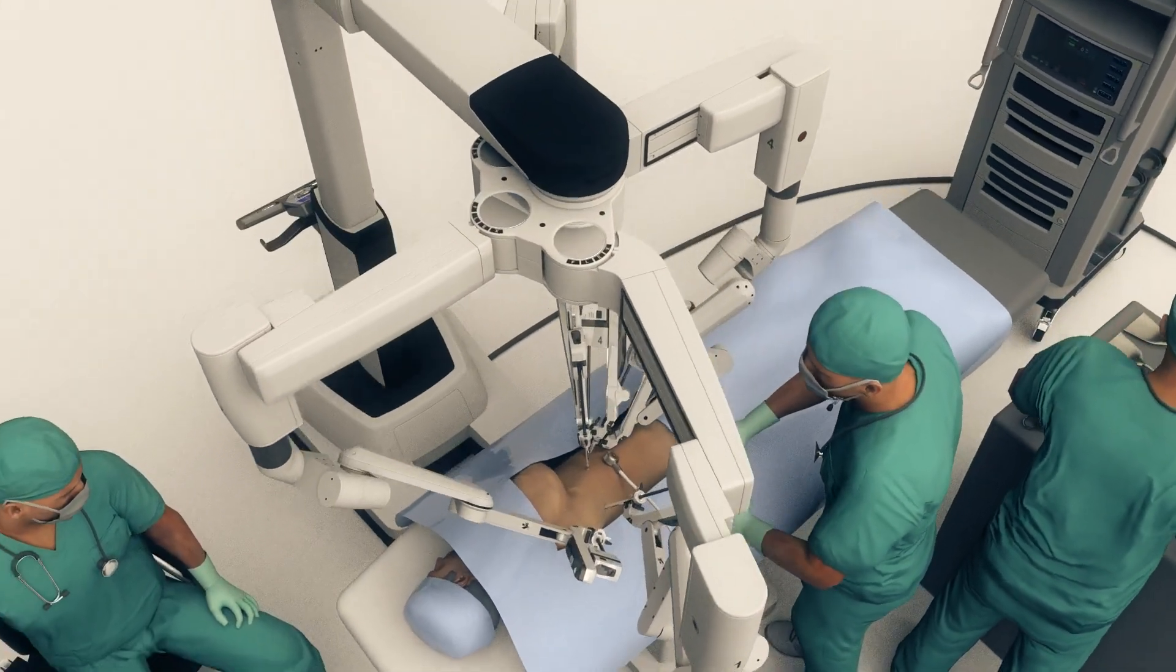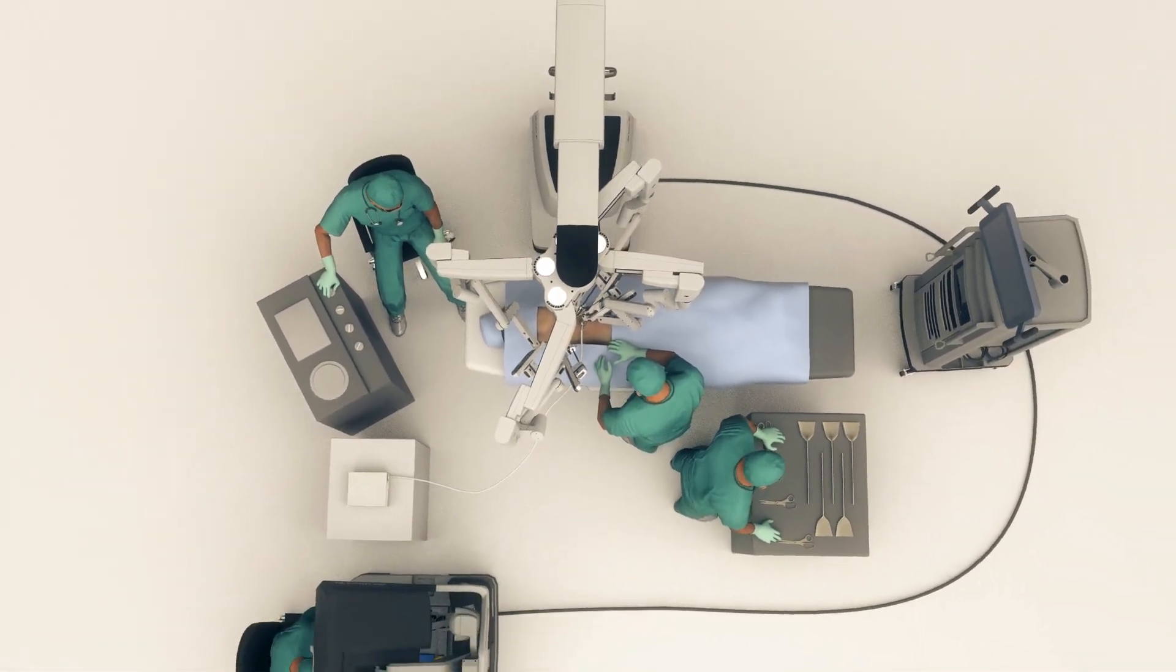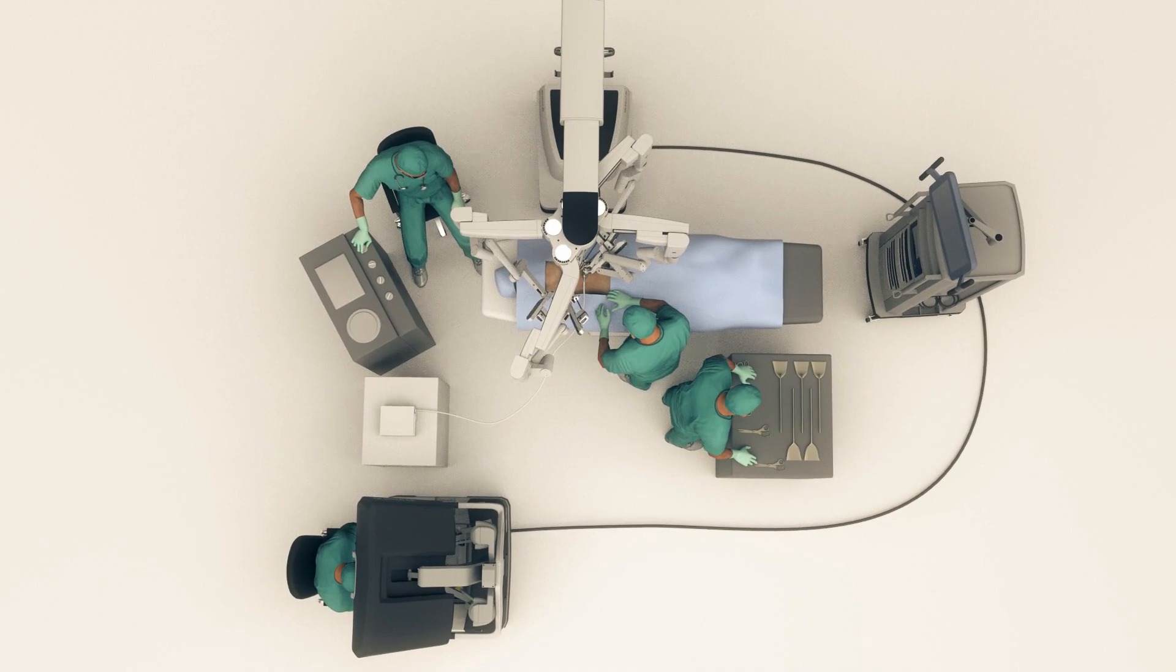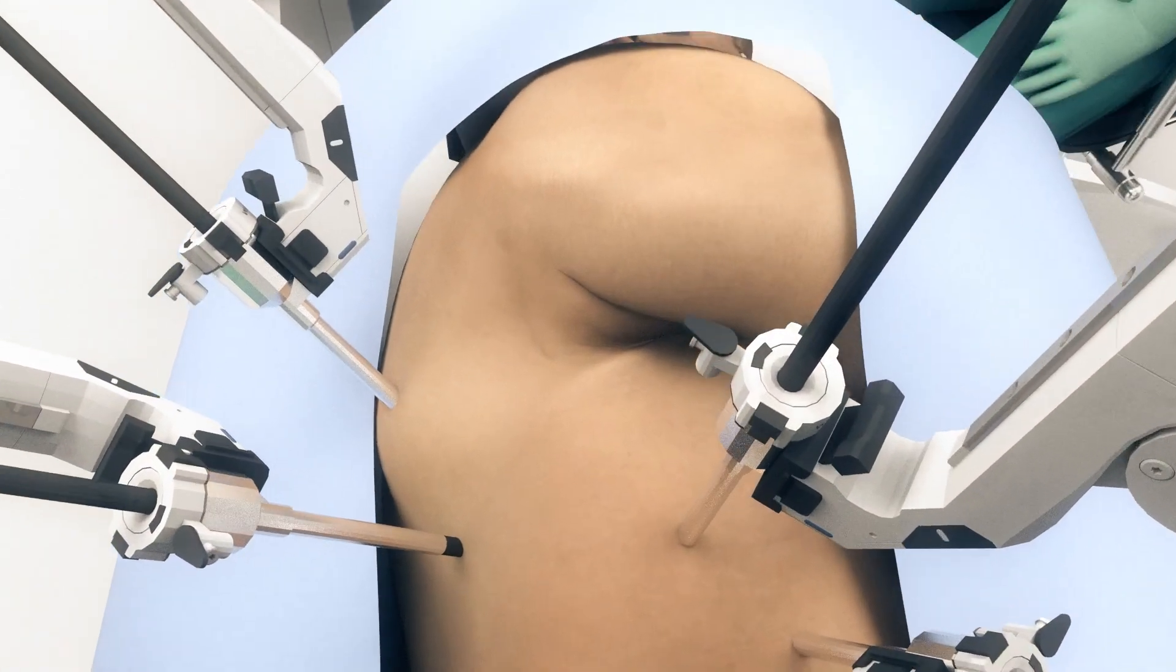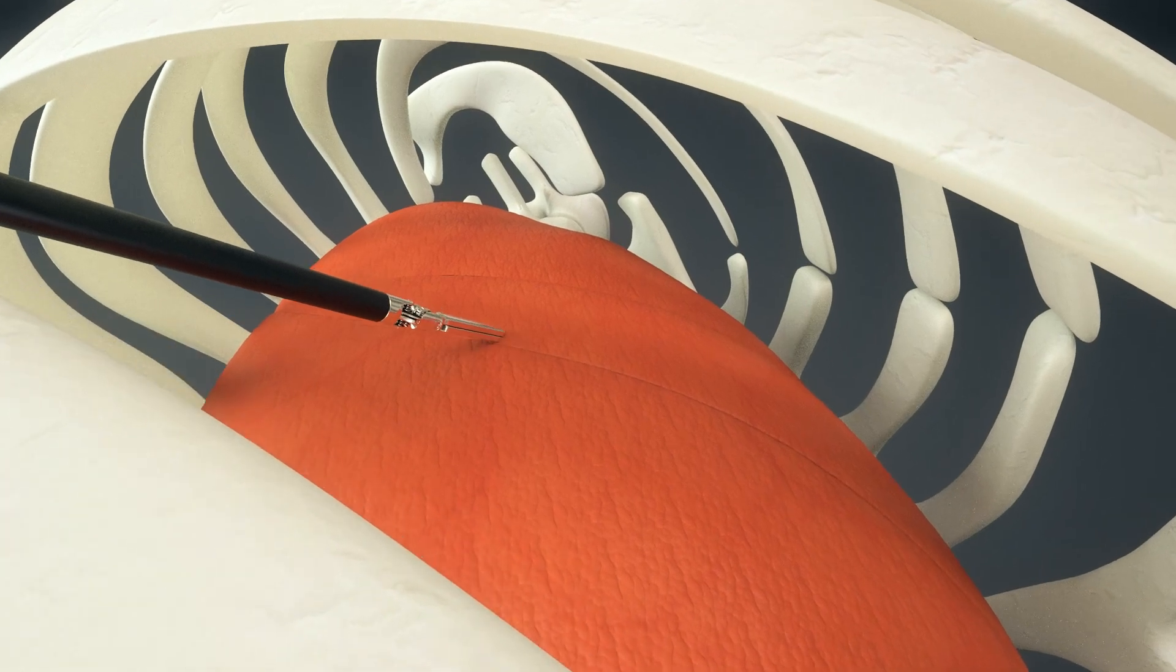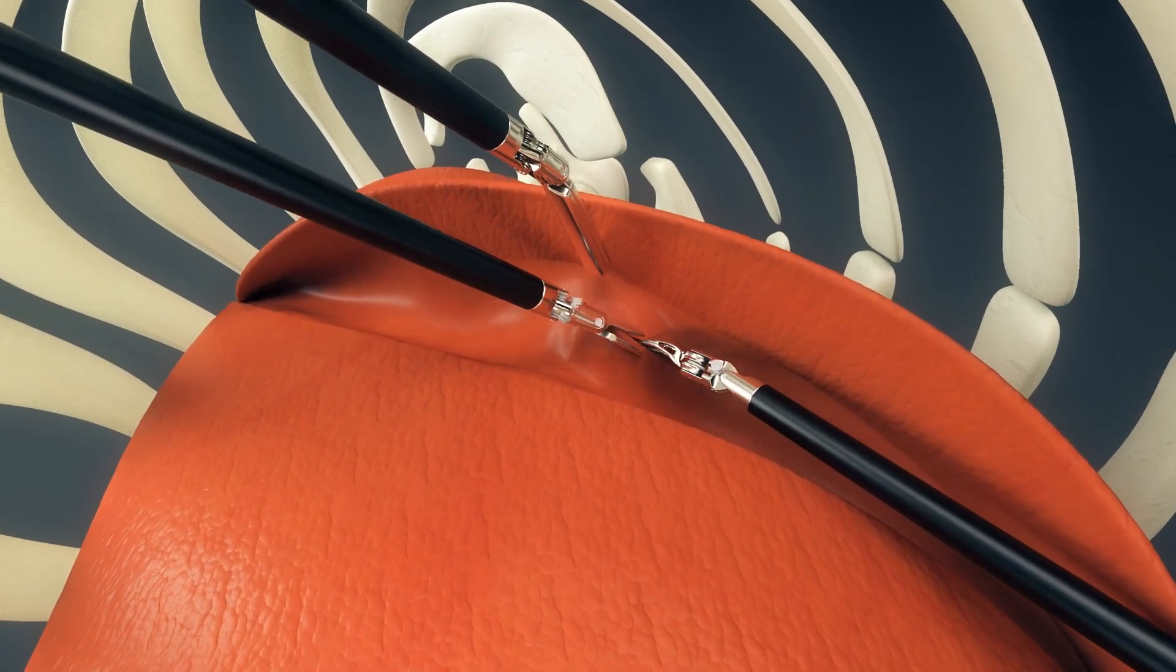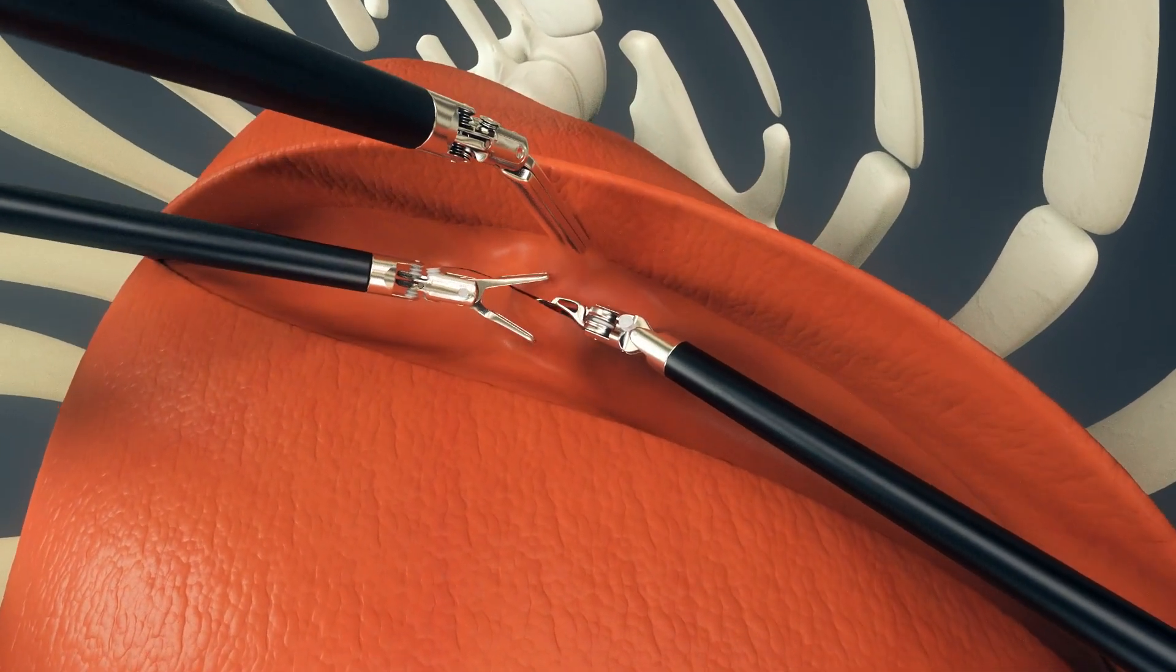Patients, asleep under anesthesia, lie on their side while the surgeon makes up to five small puncture incisions. The robotic instruments gain access to the inside of the patient's chest through thin metal tubes called trocars. These trocars provide ports that allow the camera and instruments to glide smoothly in and out during the procedure.